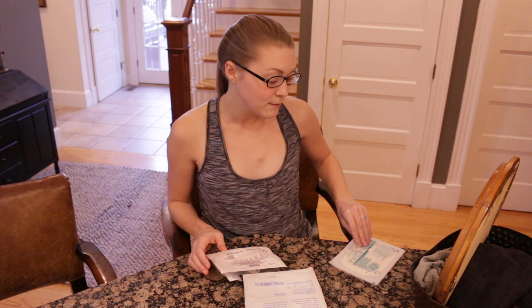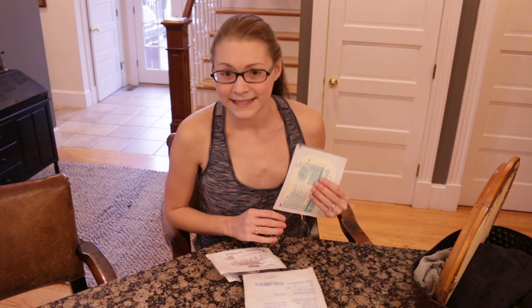I've found that extension works really well, but since I'm not going on IVs I'm not going to use one today. I'm just going to hook up a cap to the end of the Huber needle and then put a sterile dressing on. Usually for a monthly flush I don't put a dressing on — I'll just leave it hooked up, flush my saline, my 100-unit heparin, and then de-access. But today I am going to put a sterile dressing on as well.